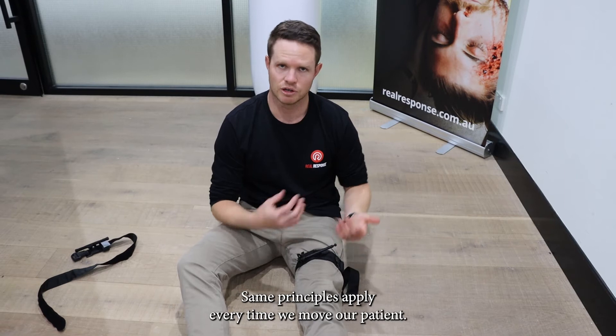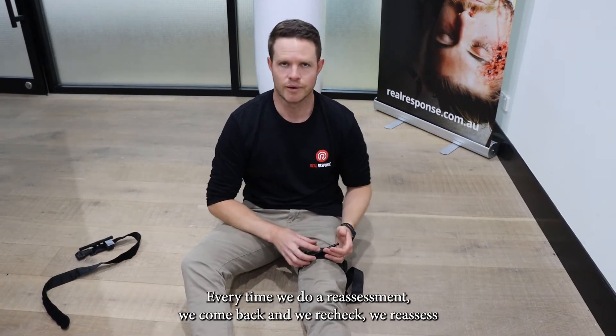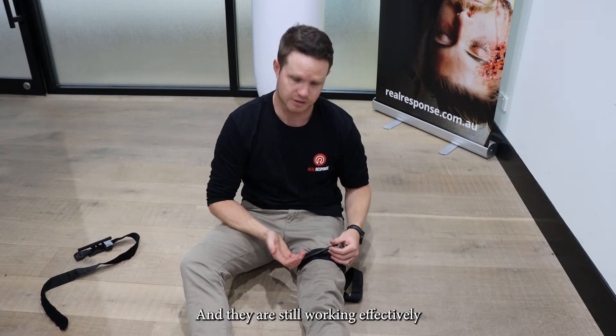The same principles apply every time we move our patient and every time we do a reassessment — we come back and recheck those interventions we've applied to make sure they have not failed and are still working effectively.